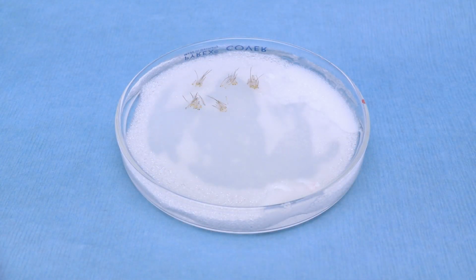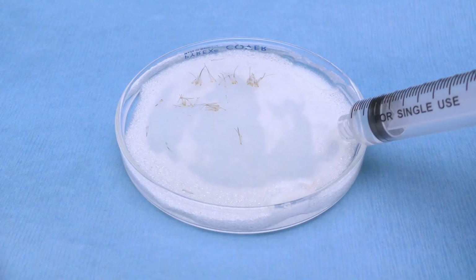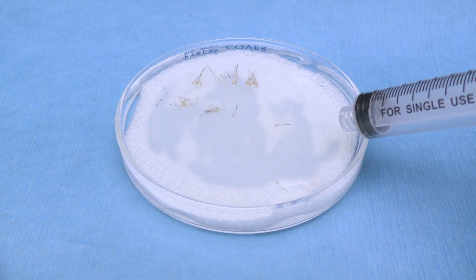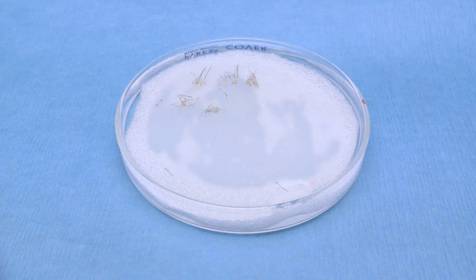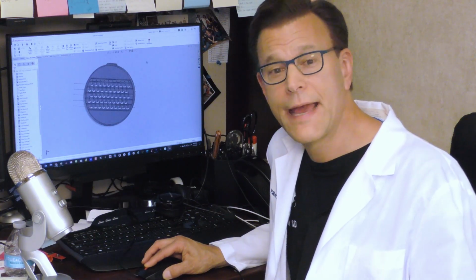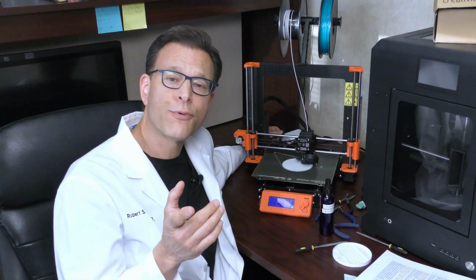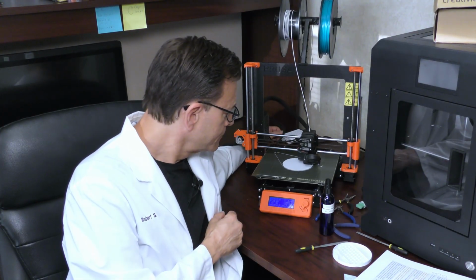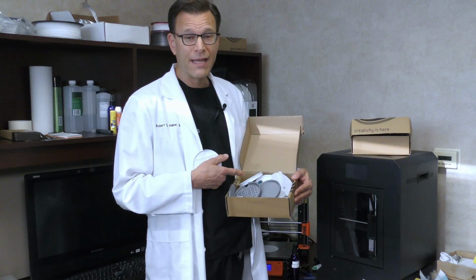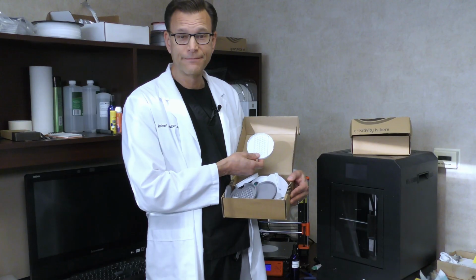Petri dishes with a rest-on foam insert can also be used. Neat piles of grafts can be arranged on the foam, but if too little fluid is used, the grafts can become dehydrated, and if too much fluid is used, the neat little piles float away. A number of alternatives exist, but I decided to create my own. I use SolidWorks as my 3D CAD design program, and a Prusa printer to print my prototypes. After many flawed iterations, I finally arrived at my current graft-holding tray design.